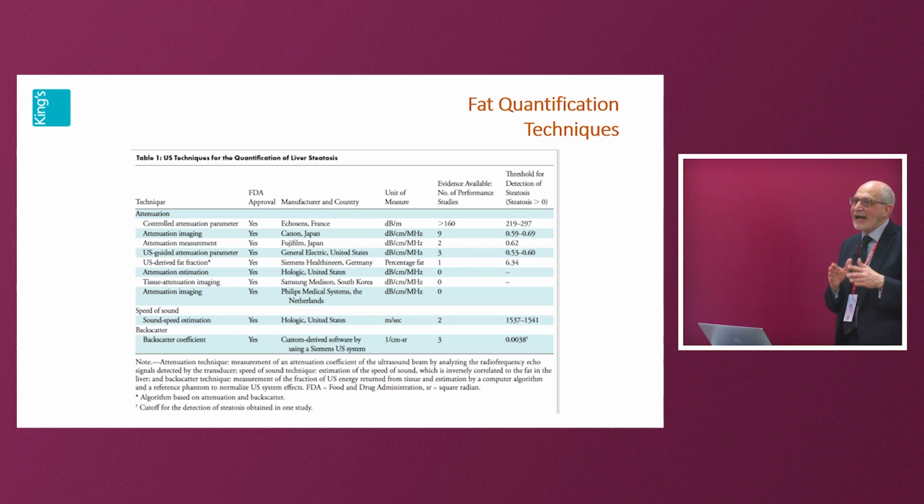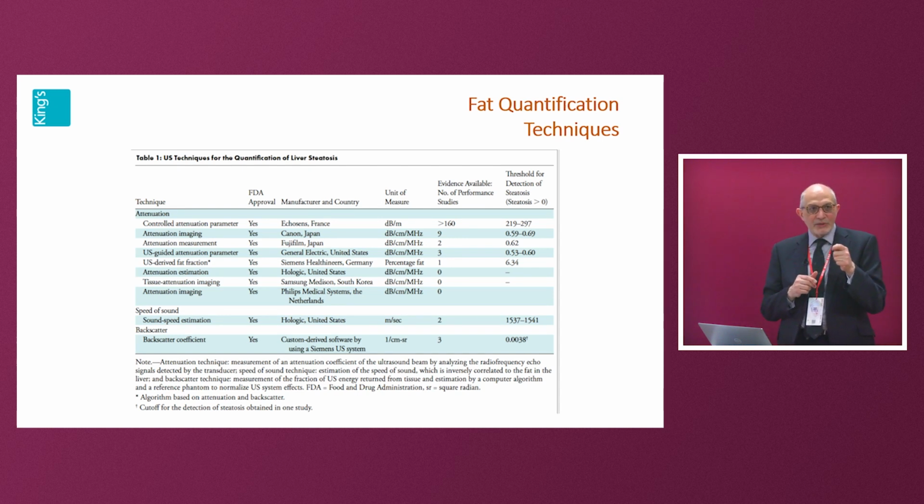And I think we're only now teasing out, with quantification of fibrosis, whether the figures between the two machines can be equivalent. Controlled attenuation parameters on the FibroScan. For those of you who are familiar with FibroScan, this is a hepatology tool. It's an office tool, a standalone machine that has no ultrasound capabilities for visualization, so you don't see any of the organs. You're just putting the FibroScan in the intercostal space on the right, and you're hoping the liver is there.